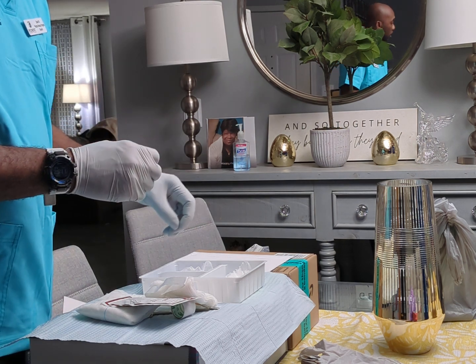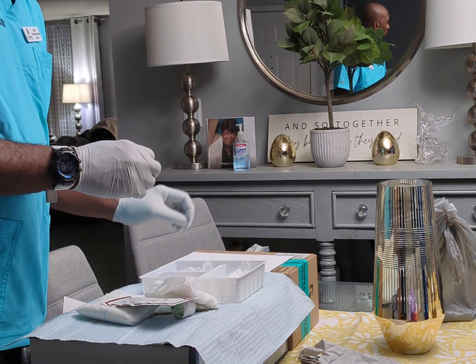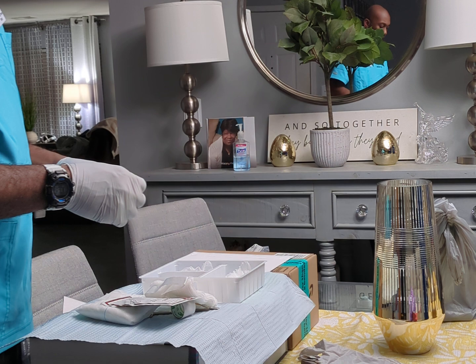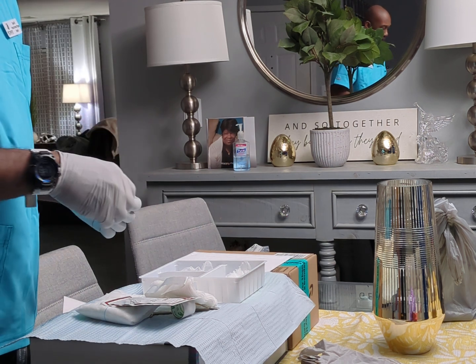Then we get another gauze, and we just make sure the edges are dry. We want to make sure the edges are dry. Once it's dry, we're going to go ahead and pack the wound.